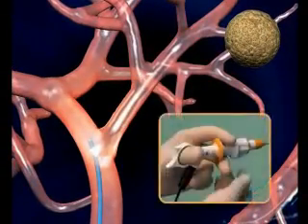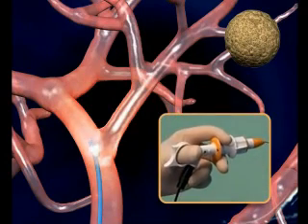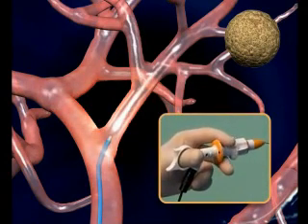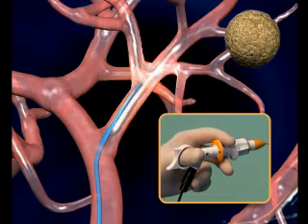When reaching another airway bifurcation, the catheters are again pushed forward and steered by manipulating the handle.